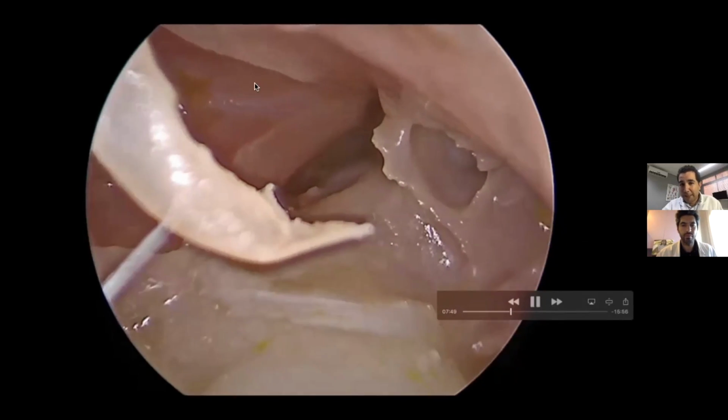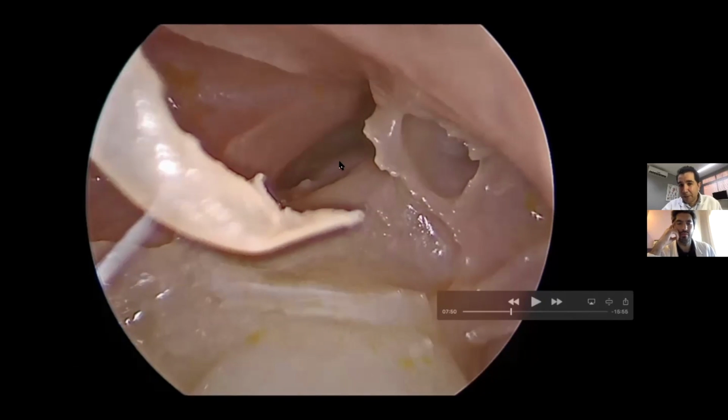So we can see here the protympanic area, the internal carotid artery here, and then you can see here the tensor tympani muscle canal, and the supratubal recess, which is above the tube. So this is a new structure, or a newly named structure, that was found by Dr. Nirmal Patel and Dr. Nicholas Jufas from Australia, and they call this the protympanic spine. The protympanic spine is a very important landmark.